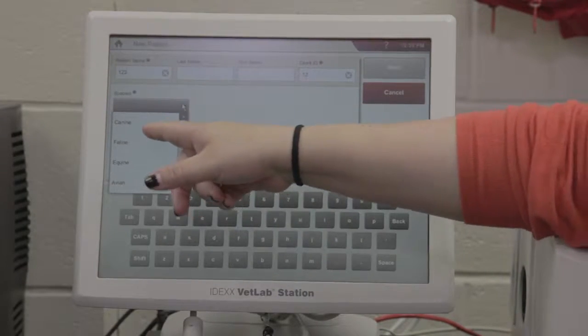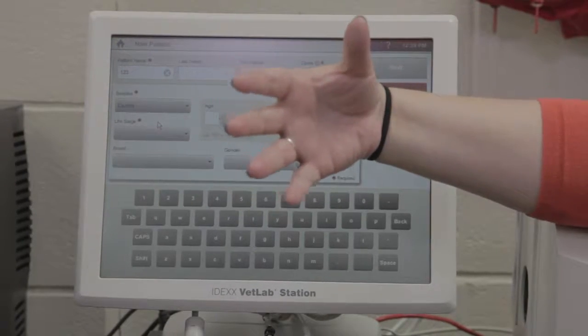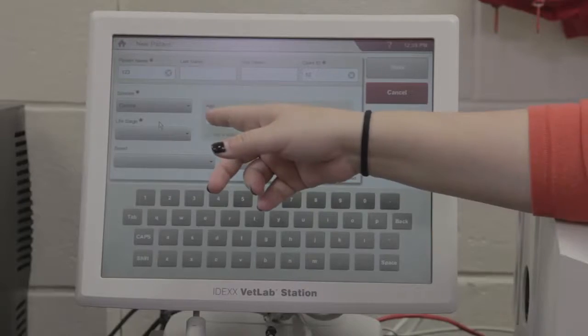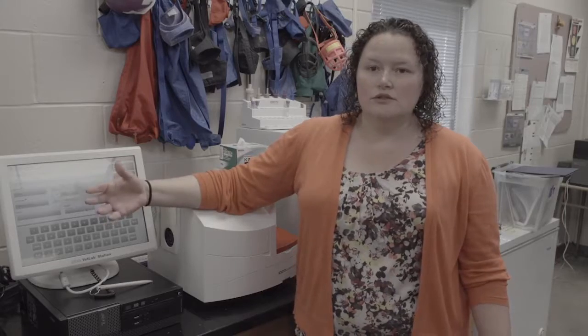You're going to tell it your species and a life stage. So for life stage, you can either choose puppy or kitten, adult, geriatric, or if you put in an age, it will actually auto-populate to the specific life stage. So if you put 10 years old, it's going to say that it's geriatric. If you put 6 months old, it's going to call it a puppy or a kitten.